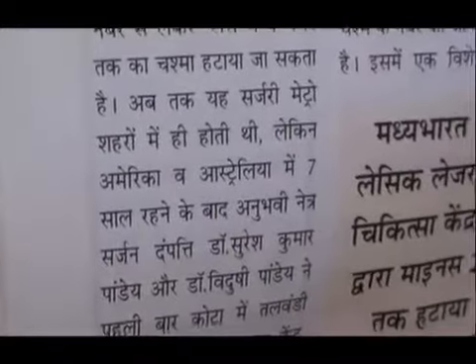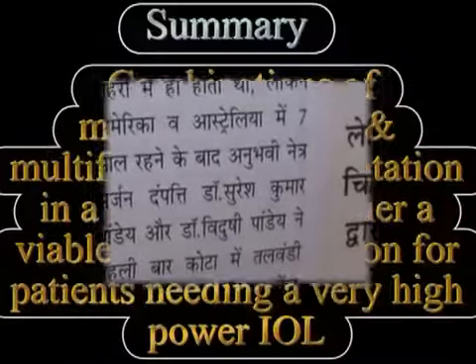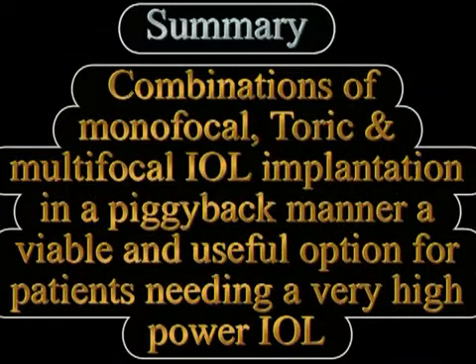Finally, the viscoelastic is removed from between the IOLs as well as from the anterior chamber. Postoperatively, the patient gained a vision of 6/9 and N6 unaided and was extremely happy with the results. To summarize, primary piggyback IOL implantation can be done not only to achieve a high IOL power in cases of high hyperopia, but different combinations of monofocal, toric, and multifocal IOLs can be used in a piggyback manner to achieve good refractive results and spectacle independence.